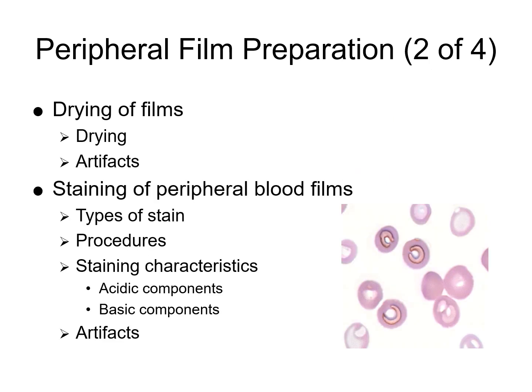After preparing a peripheral blood smear, drying is an essential step to preserve cell morphology and to prevent artifacts. Films should be dried quickly and evenly, preferably by air drying at room temperature. Avoid excessive heat or prolonged drying, which can cause distortion or even shrinkage of cells. Improper drying can lead to artifacts such as cell shrinkage, crenation, or morphological changes that could complicate microscopic interpretation.